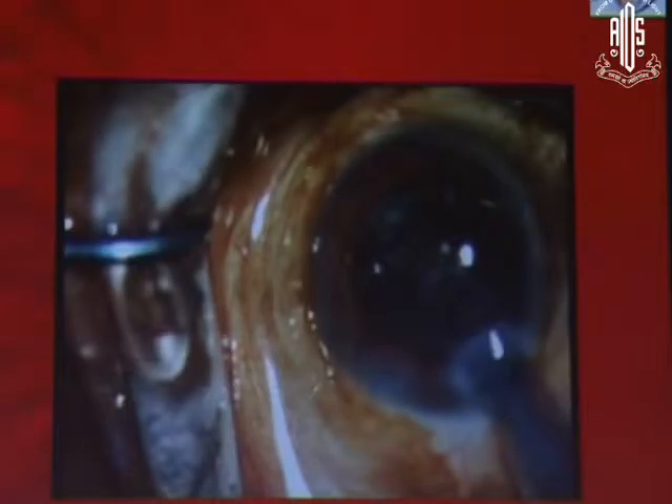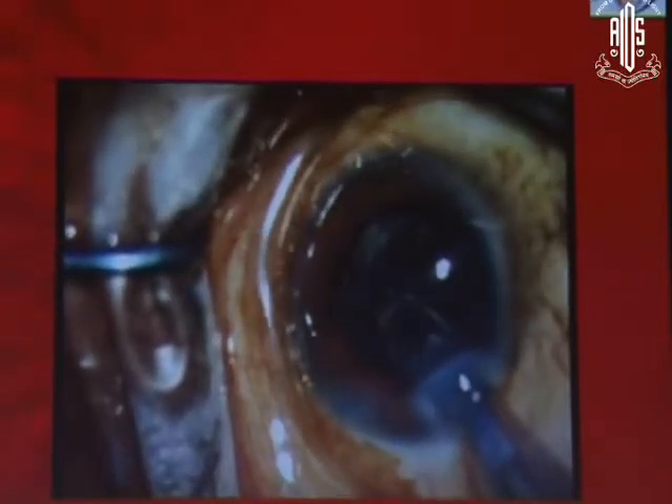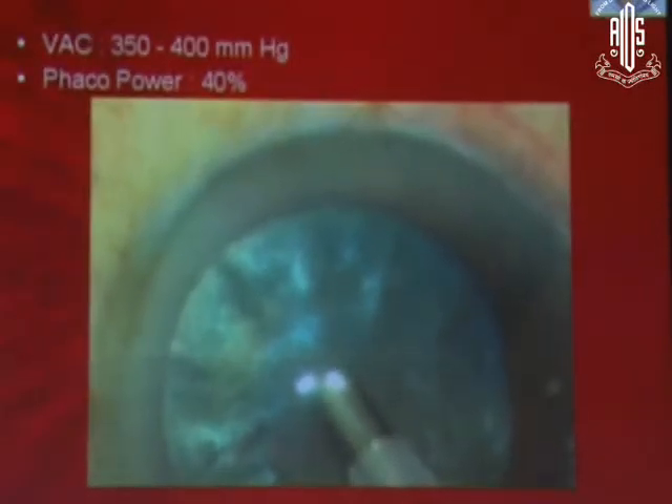This is the way you manage an Argentinian flag sign provided the cataract is not very dense. Fortunately for me, this cataract was not very dense and this patient wanted a multifocal. I didn't put a multifocal lens — I just put a unifocal hydrophilic lens into the bag and the patient did well.